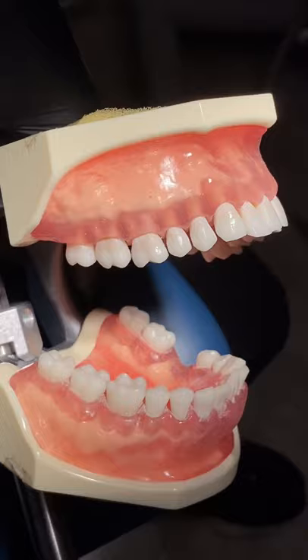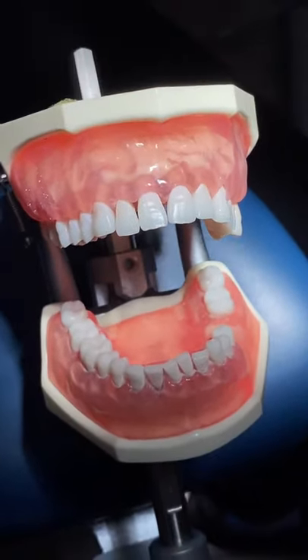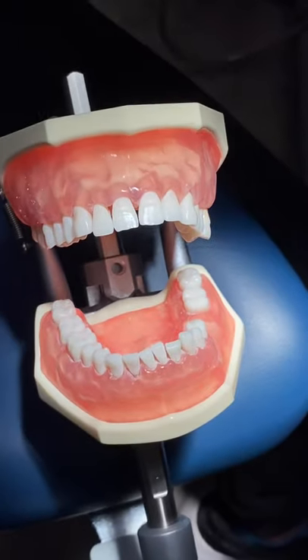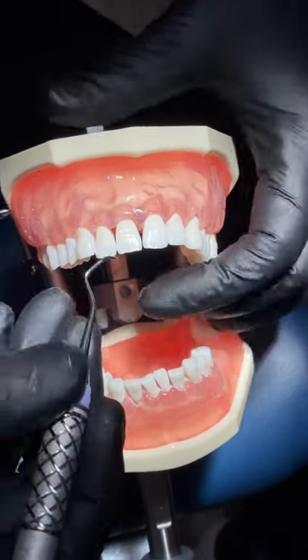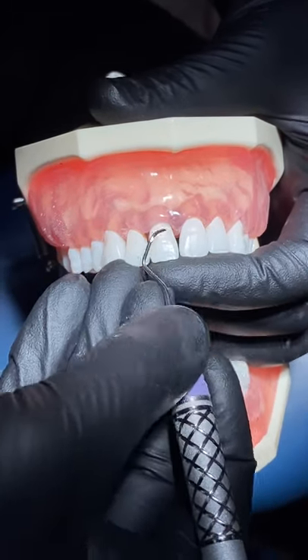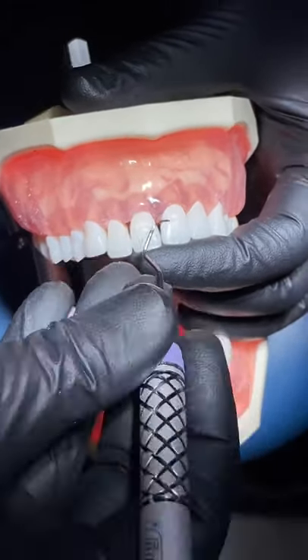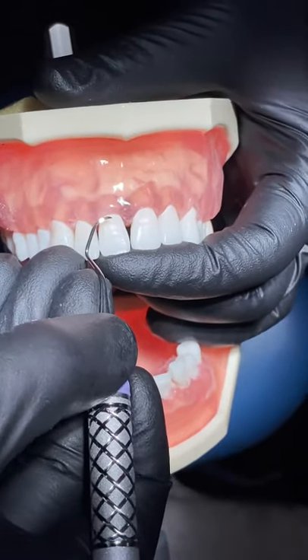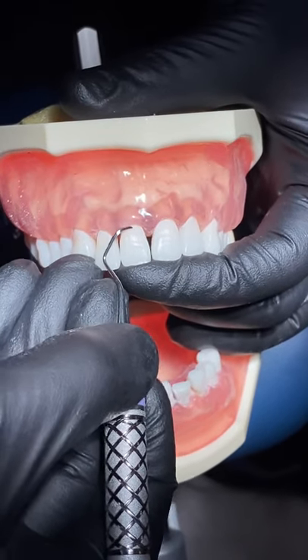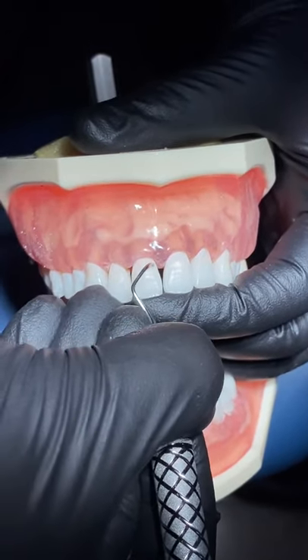For anterior teeth, in order to find the correct working end, we're going to find the end that wraps and adapts to the surface that we're working on. That end wraps towards the mesial, and we will get our blade angulation of 70 to 80 degrees. Make small overlapping working strokes.